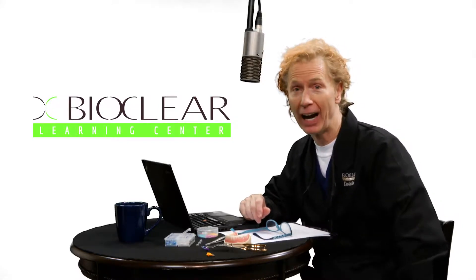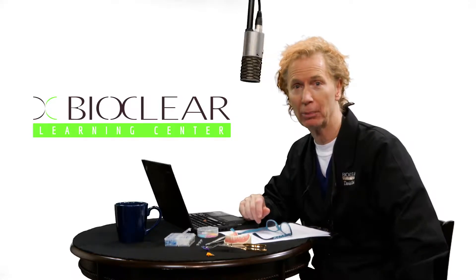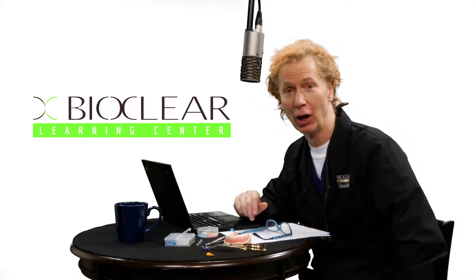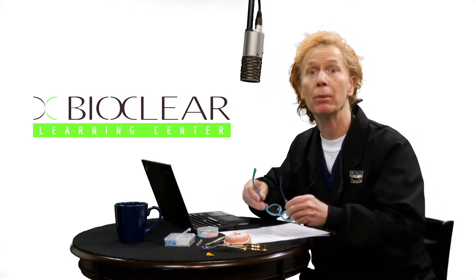Let's quickly review the five steps for success with modern composite — or if you're outside of the United States, modern composite. Number one: pre-wedging.